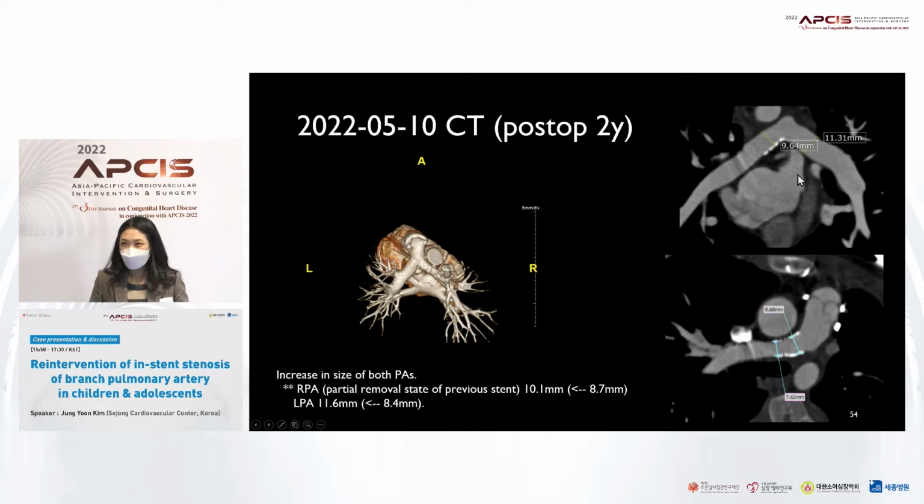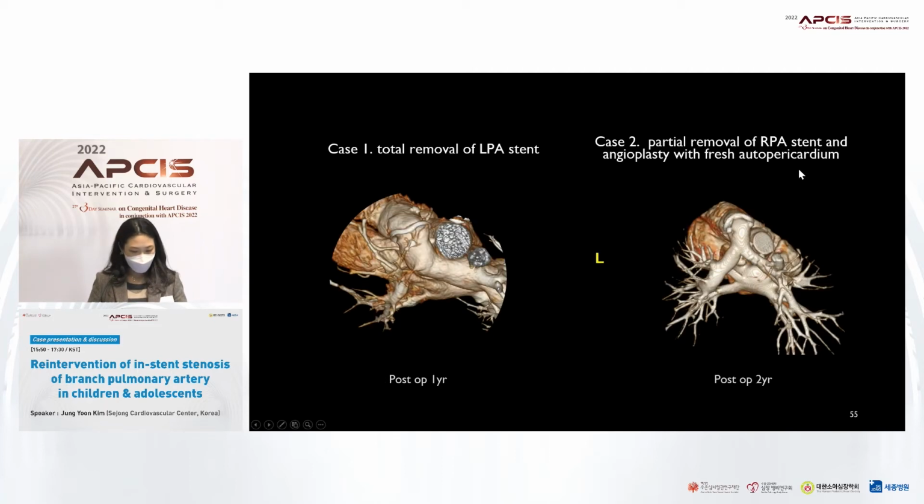But Dr. Sung Kim wants total removal of the stent, which is preferred. It is more successful in keeping the pulmonary artery vascularity. So which is better? I don't know, but Dr. Changari wants it like this. Okay, we have 2 more cases, yeah?